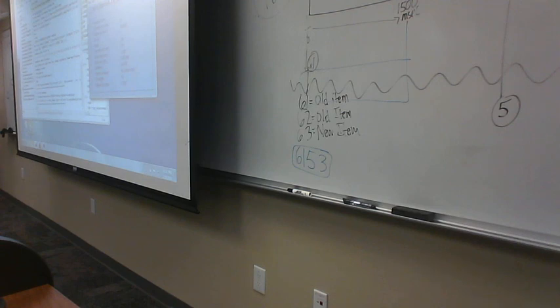As scientists, it gives us a lot of leverage and power by which to gain very detailed information reported back from people about their memory experience. And then we get to see that in the brain activity. Okay? So 61 equals that, and 62 equals that.